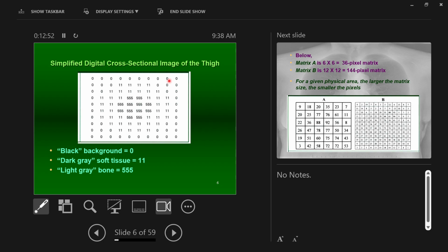So radiographically, those black parts, those parts where the pixels are not turned on, are the parts of the image that received the most exposure, right? The darkest parts of your images are those that got the most exposure. So pixels will be deactivated on the screen, showing you a black area, when that part on the image receptor received the most exposure, okay?